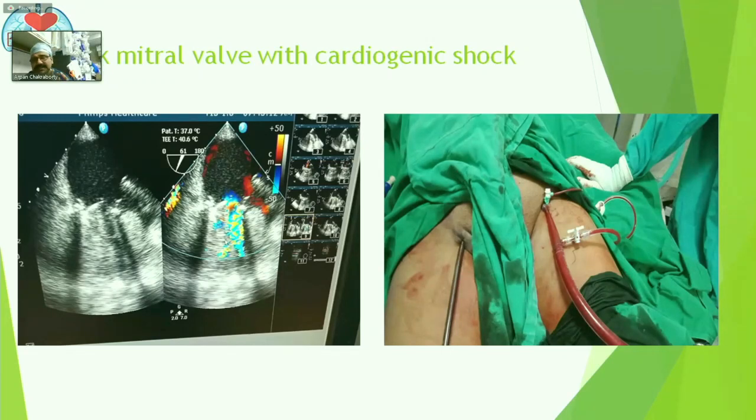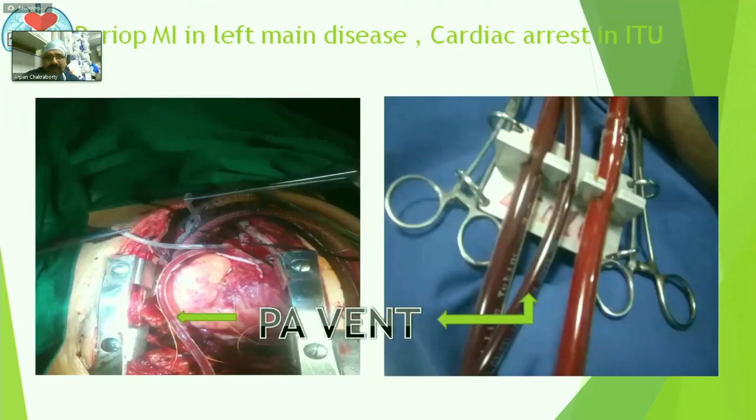So these are the conditions where many times people respond to some amount of CPR and then it comes and goes, with the rhythm and the pressures. Where you get some amount of lines, you should put a venous and arterial line, and later you can transfer it to an ECMO cannulation to start the ECMO.